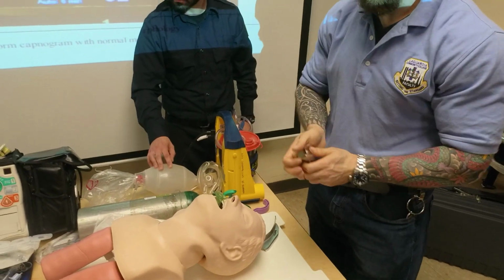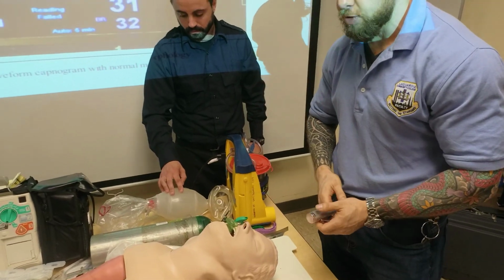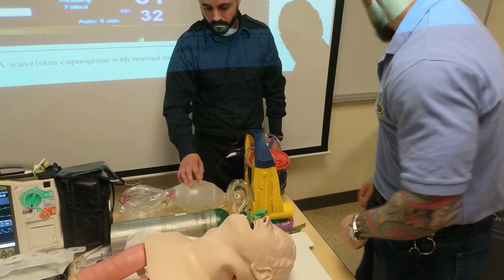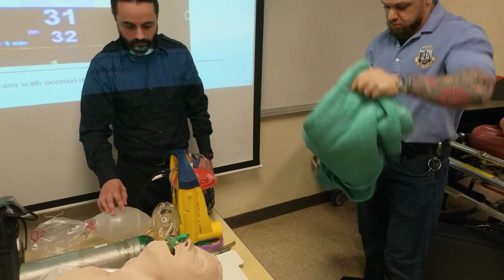That was my question. It doesn't matter, it's choice. It's choice and your provider level of execution for it. How well you know how to use it. And then we said we have to position. What should the position be? Sniffing.